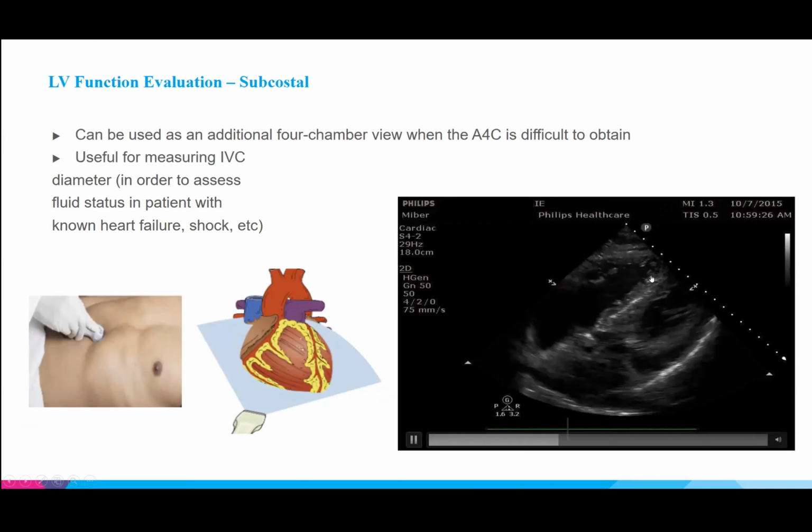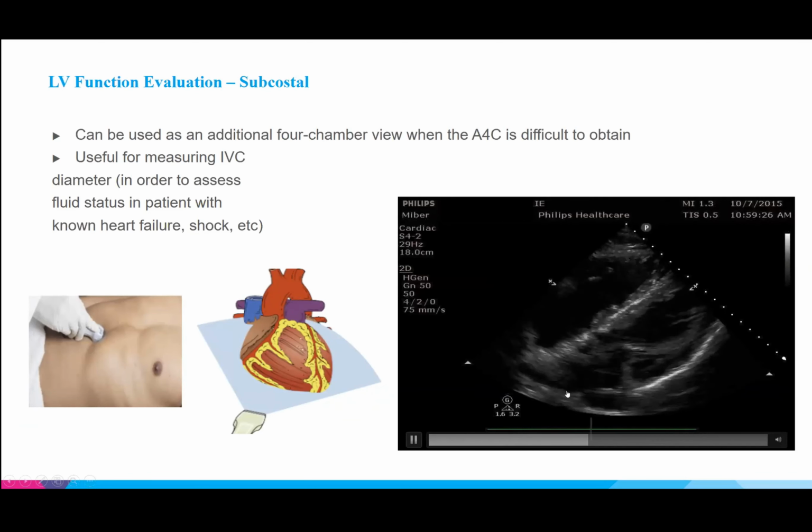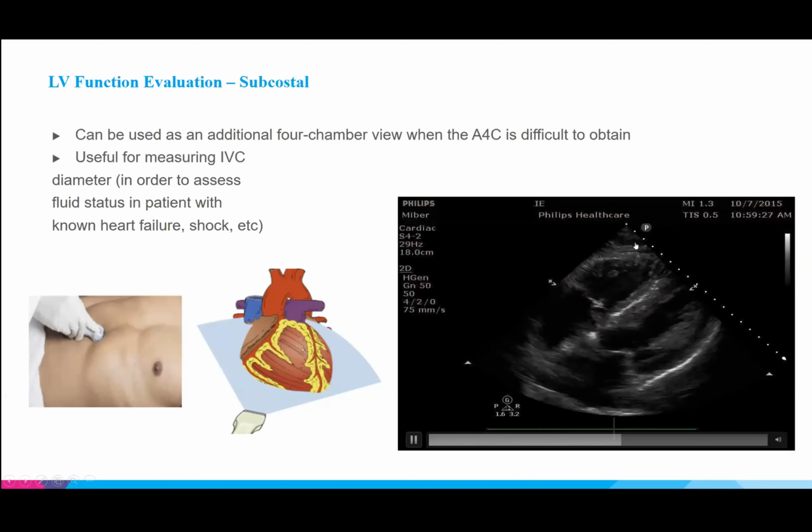Normally, if you would see fluid, we should see it all the way around, like around here, maybe a very slight sliver. Here, I wouldn't call it an effusion just based on this view. I'd want to see it more circumferential. So if anything, it's very small. This might just be a piece of the liver or some pericardial fat or structure, maybe a very tiny sliver. If you saw a pericardial effusion, you'd see it probably right up here. I see. Okay.